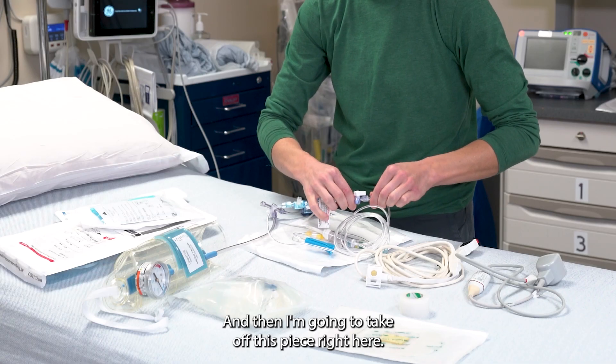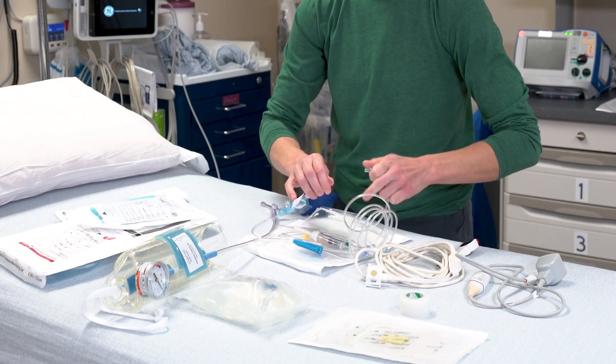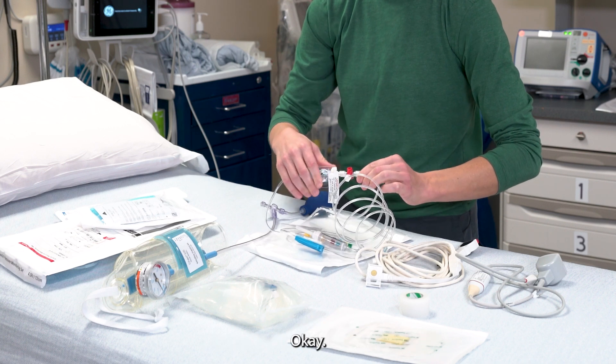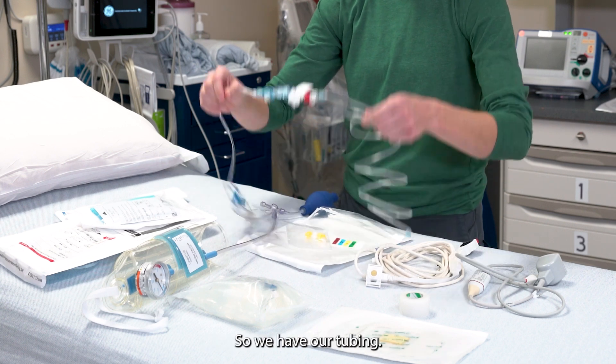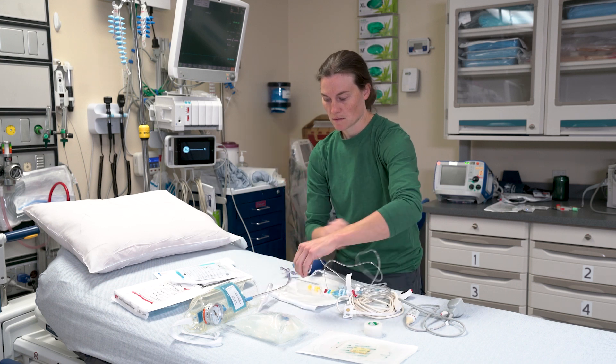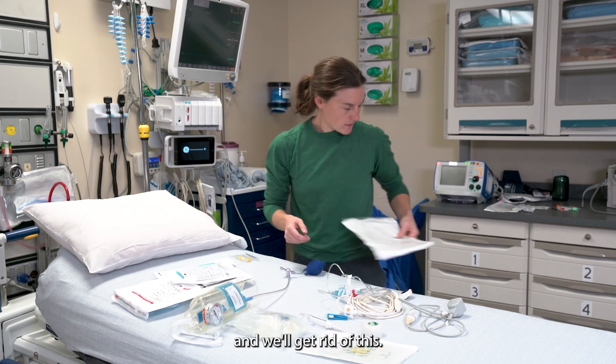I'm going to take off this piece right here and then secure that on there. So we have our tubing. Save these caps, and we'll get rid of this.